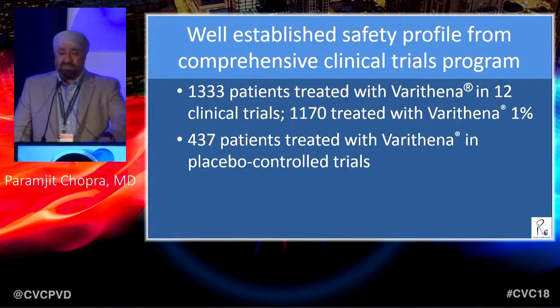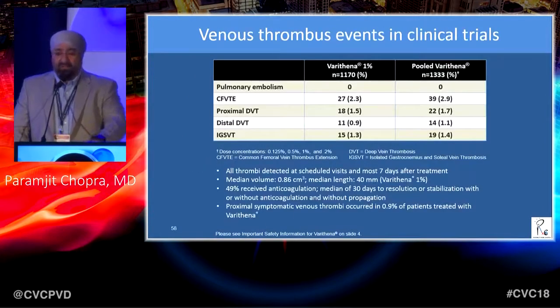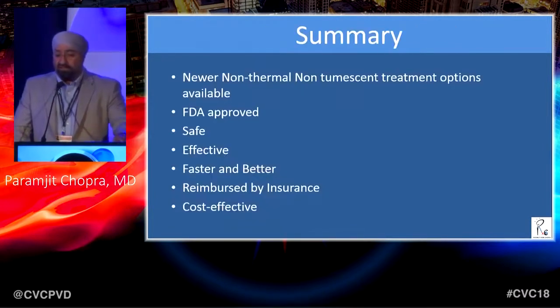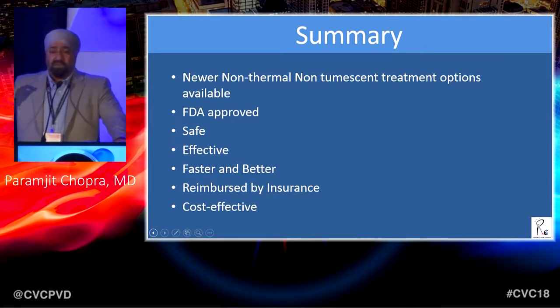To me, this is the most important element, that it's very, very safe. I've done maybe several hundred now in the last 2 years, and so we've not had, touch wood, a single problem. We want to keep it that way. We talked about the reimbursement earlier, so we know we have decent reimbursement for this. Documentation is extremely important, so pictures before, during, and after. I showed you CEAP 2 and a CEAP 6.